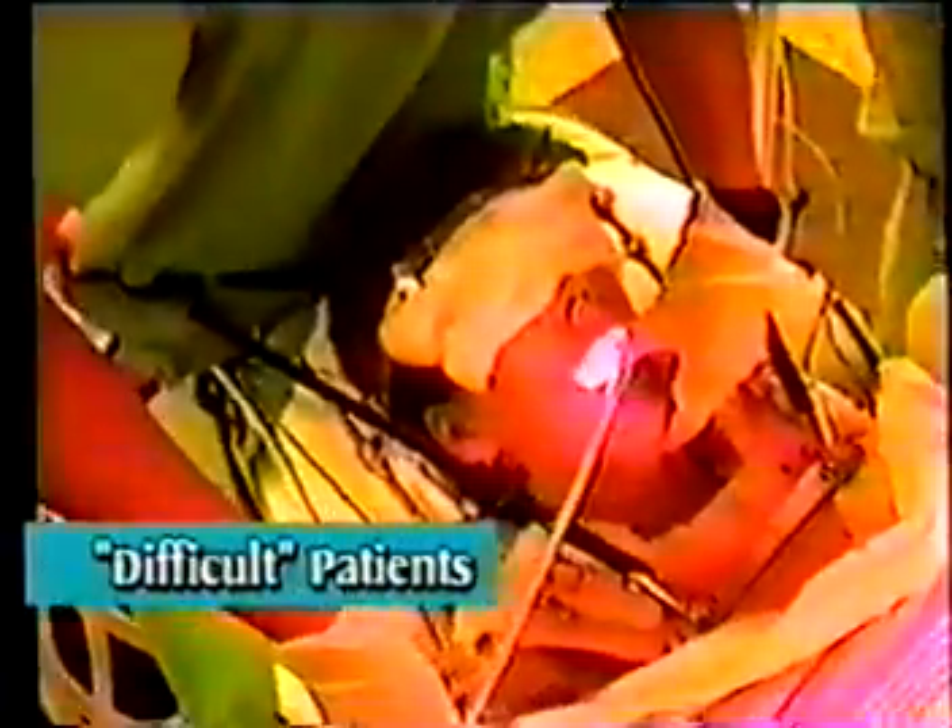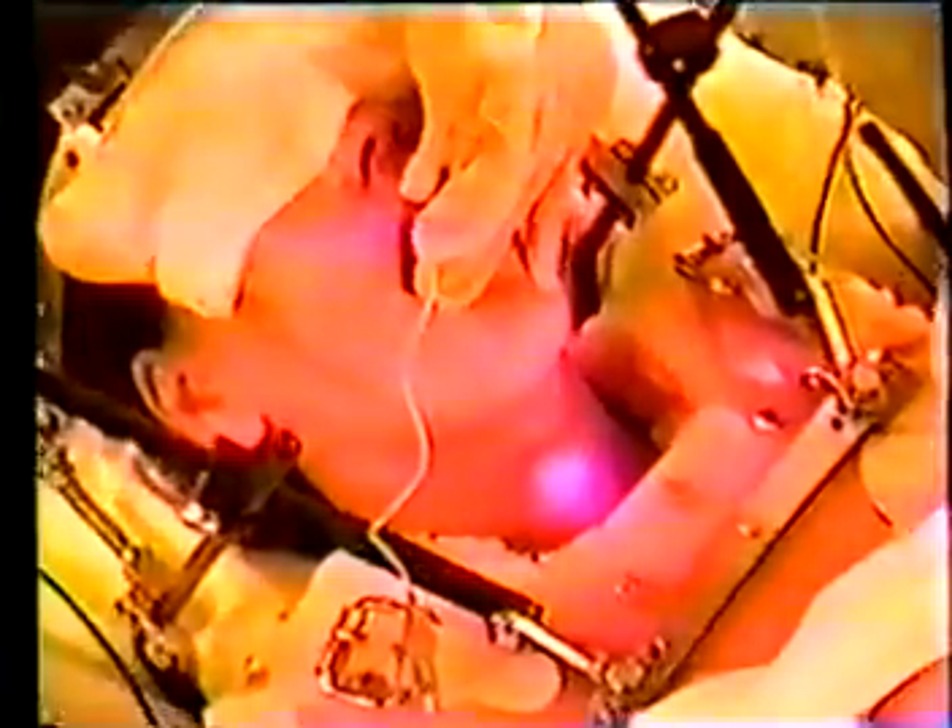The TrachLite is a versatile tool useful in a variety of patients. Because proper placement of endotracheal tubes can be performed without the need to see the cords, the TrachLite can be particularly useful in certain patients previously considered to be difficult. Patients requiring stabilization of the c-spine take little more time to intubate than routine patients.